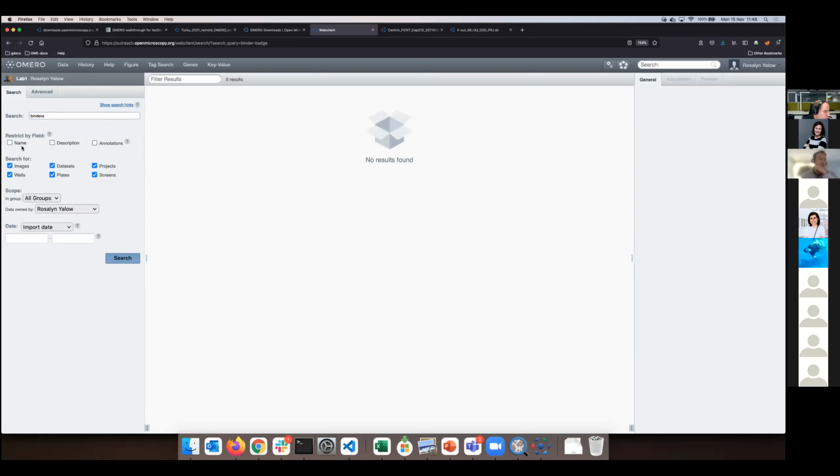There is also usually an indexer. There's a system under the hood called Lucene that indexes the data. So sometimes you might have a bit of delay. So if you are annotating quite a large amount and the indexer needs to kick in and index all the content, it's usually fairly quick. But if you do a large import, that could take a bit of time.